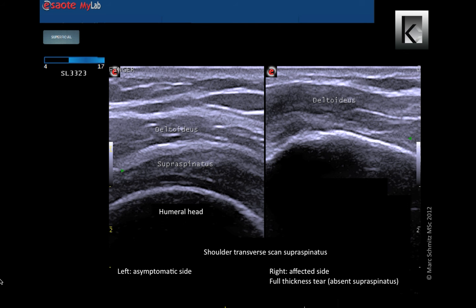This 60-year-old lady has a full thickness tear. As you can see there is a supraspinatus missing on the right side. The supraspinatus tear compromised the stability with a superior migration of the humeral head as a result. Showing her the left-right comparison, she completely understood that the goals she had, like returning to her sport, were not realistic and that she had to set other goals.